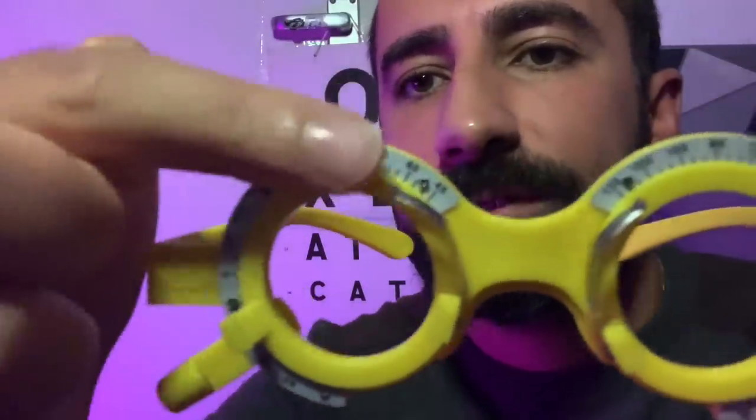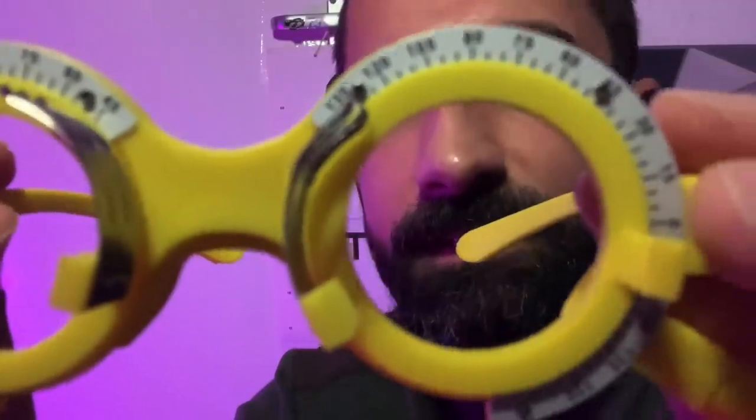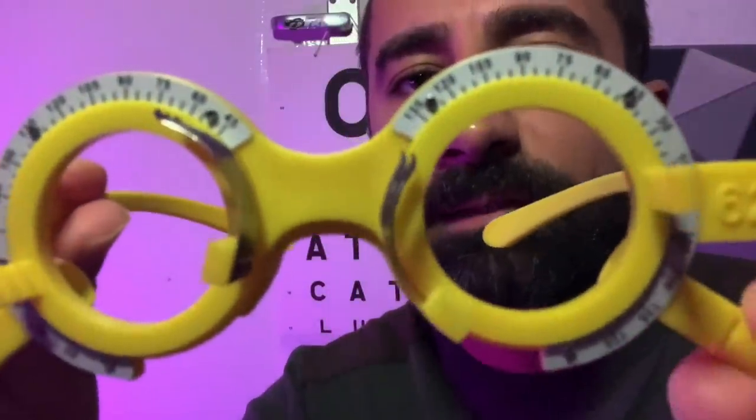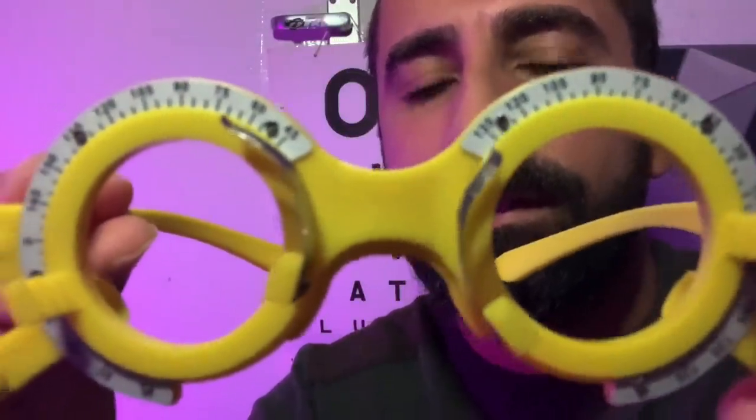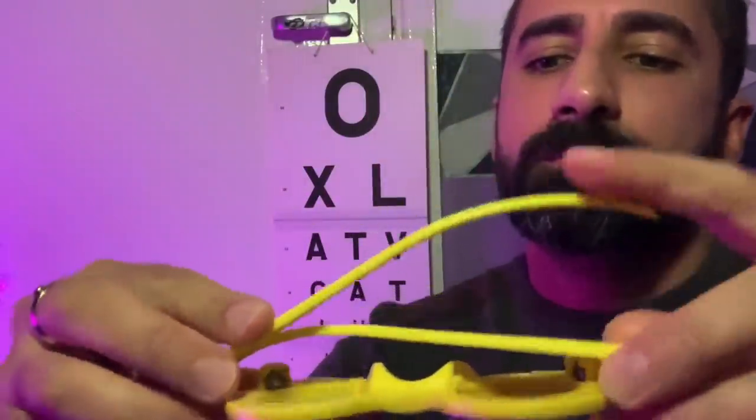And you have the scale here, so we can align the cylinder at the correct axis. That gives you the best vision. Okay, so let's get the trial frame on and perform some retinoscopy for you.